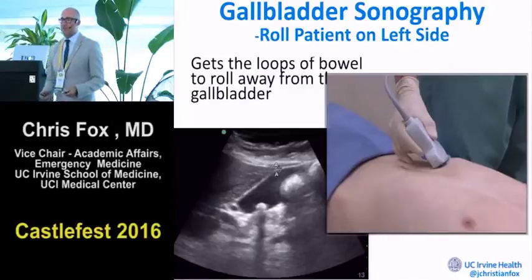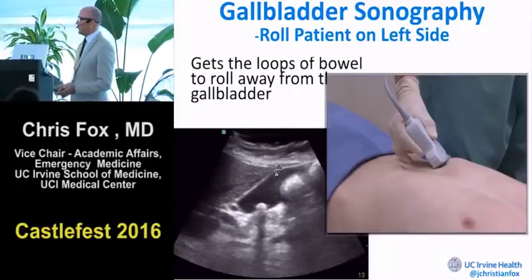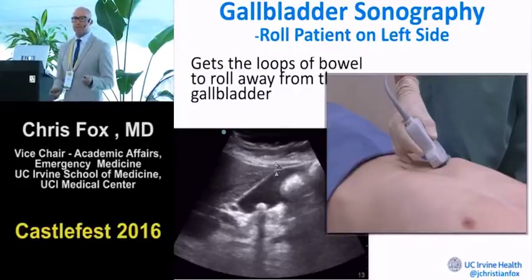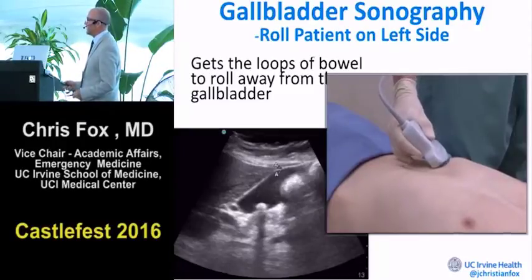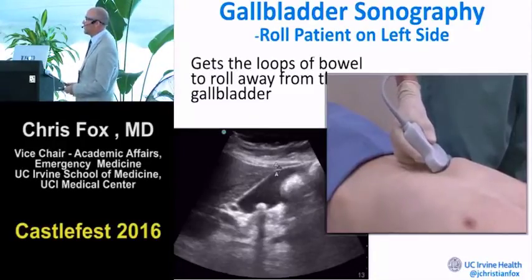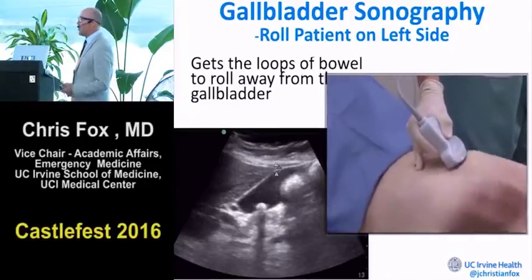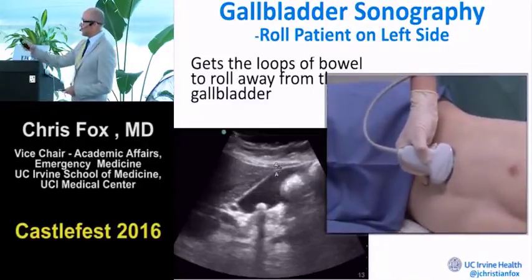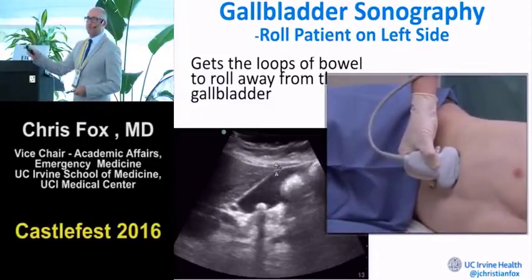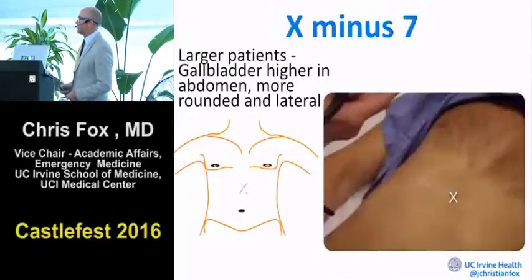And that's really the ultimate conundrum when you're doing biliary ultrasound, is trying to differentiate, wait a minute, is that air inside the duodenum or is that a stone inside the gallbladder? So that's kind of how I think of it. And again, in that transverse plane, you can have the patient take a deep breath, you roll them over on their side, gets that duodenum to slide out of the way, and this is really how I get the image here. I roll them on their side. I'm still trying to get away here with using that large footprint transducer whenever I can.